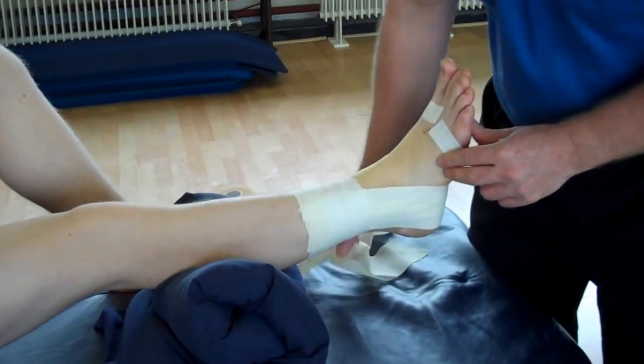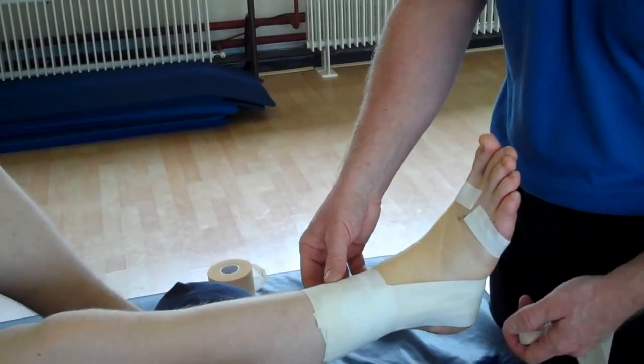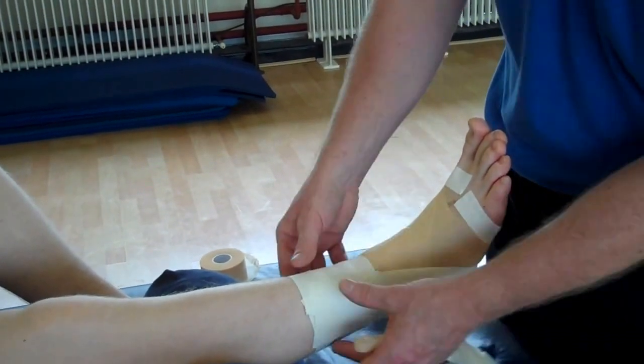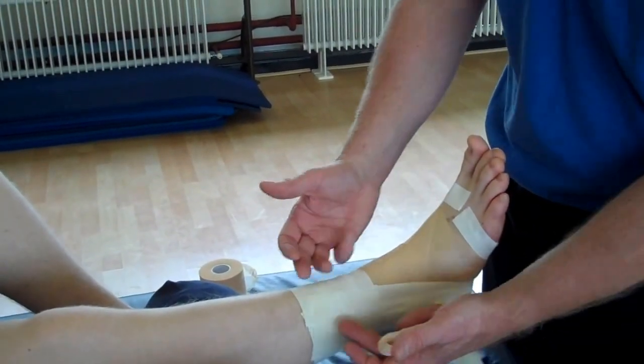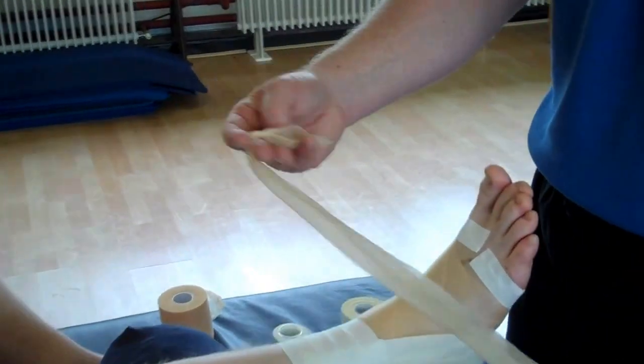So what we need is a little bit of under wrap, just to show you an example. What I've done so far is applied three stirrups and locked off the under wrap to protect the skin. From the inside out — this is just for the demonstration.